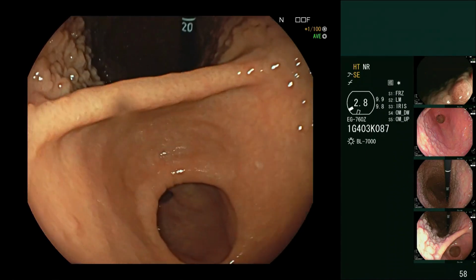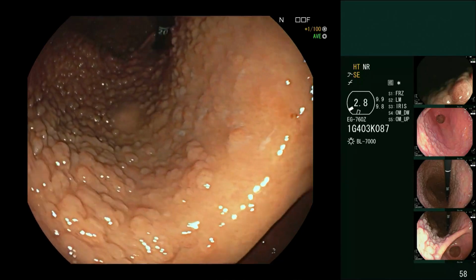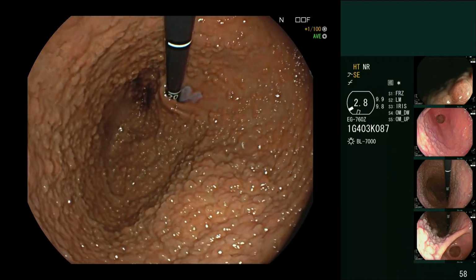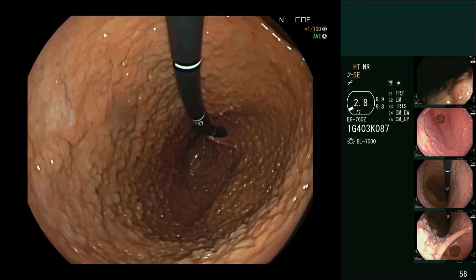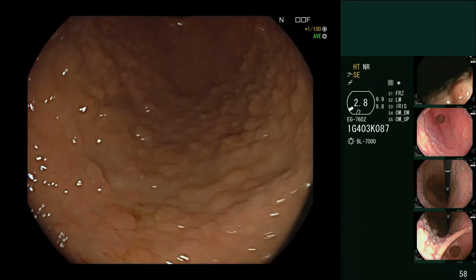And finally, if you find nothing, you take random biopsies as per any of the protocols, Sydney, Cambridge, there are a few of the stomach. And the idea of this is probably outdated, to be honest, if you're good at endoscopic imaging, but sometimes this picks up something and sometimes it gives you an answer.